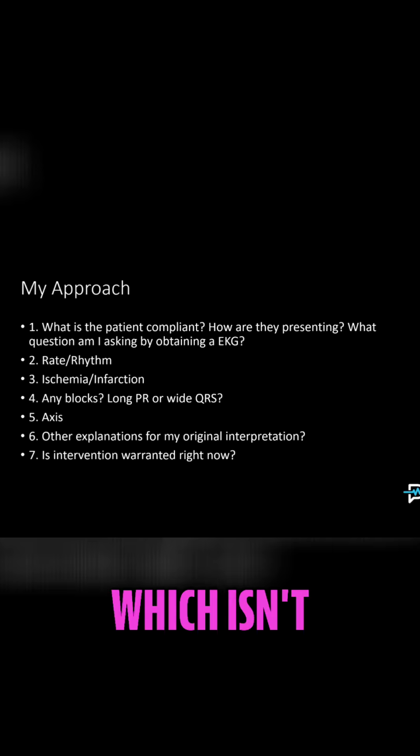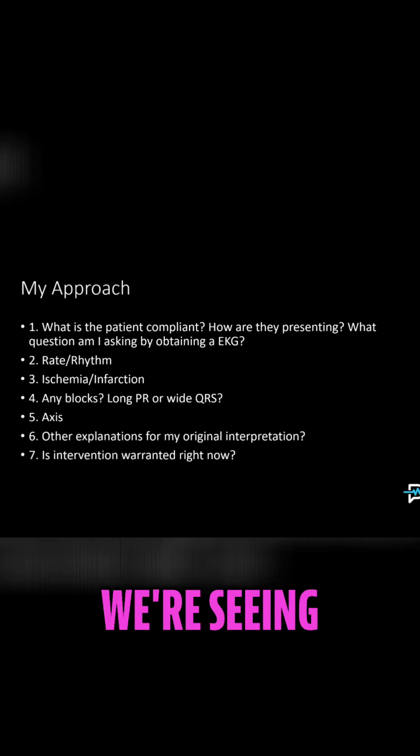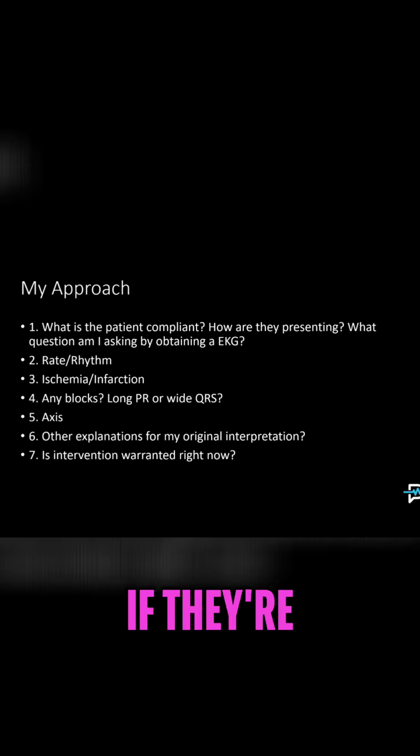And the first step, which isn't one that I feel like is commonly taught, is super important. We're never analyzing an EKG in isolation. We're looking at a patient, we're seeing their chief complaint, we're seeing if they're sick or not sick, and we're asking a question by obtaining an EKG.